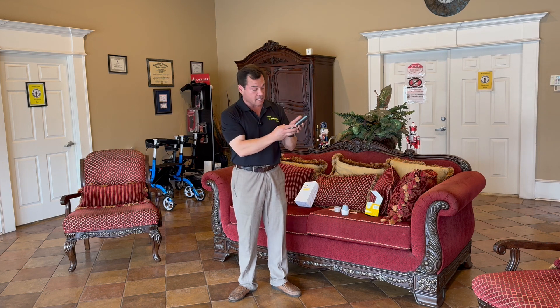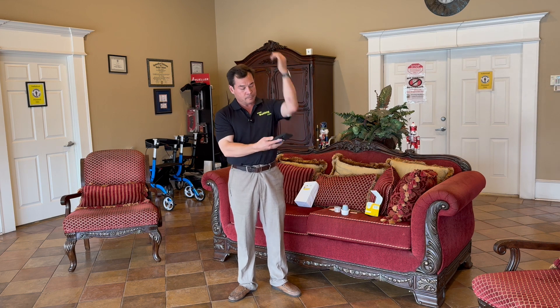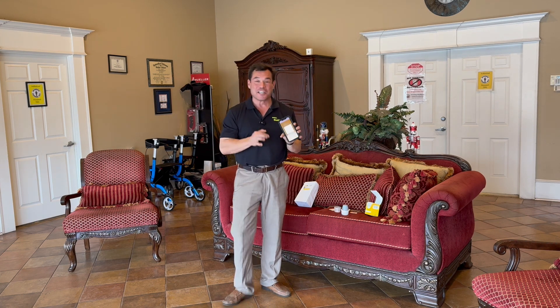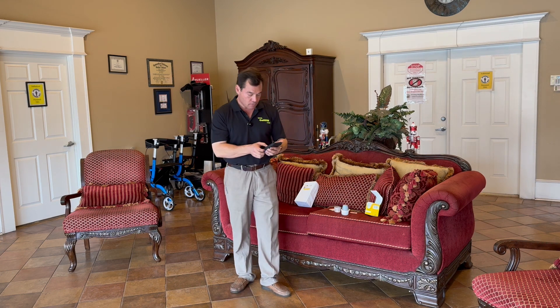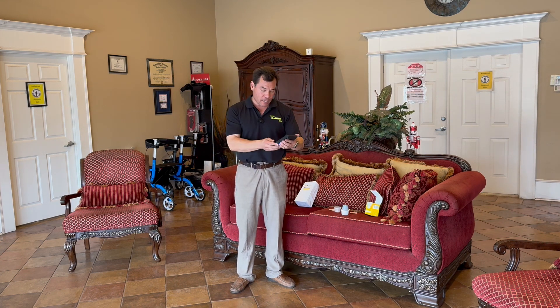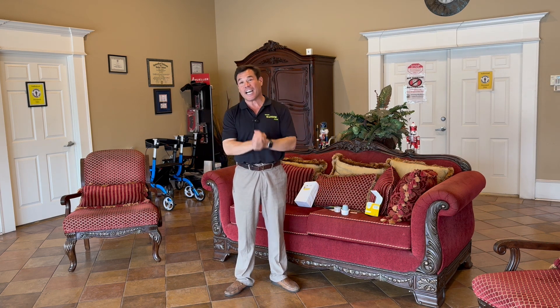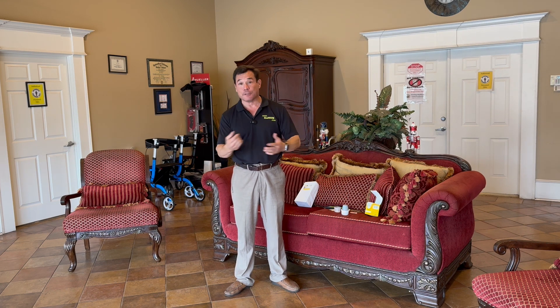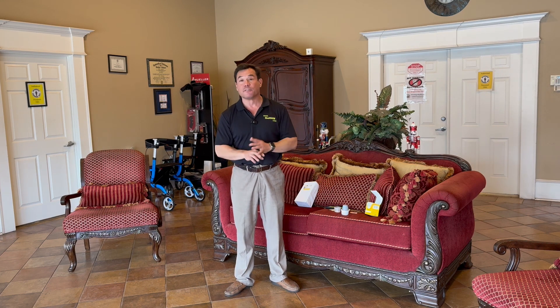The next step is to scan the new sensor. You get the check mark and it's going. These sensors take a full hour to calibrate with your phone, so while you're waiting for the countdown before it can accurately check your blood sugar, if you need to check it with a finger stick, you may have to. This is the same with both the Freestyle Libre 2 and the Freestyle Libre 3.